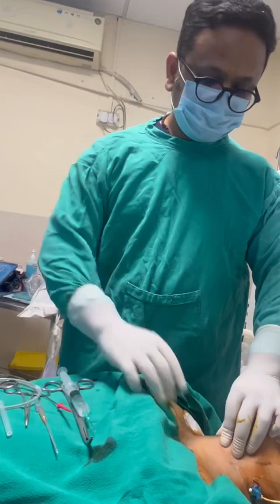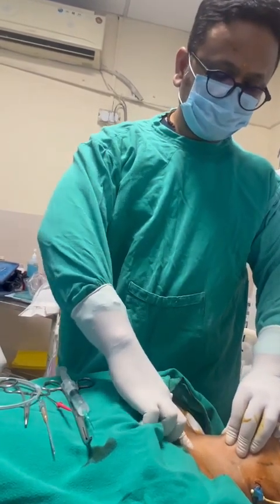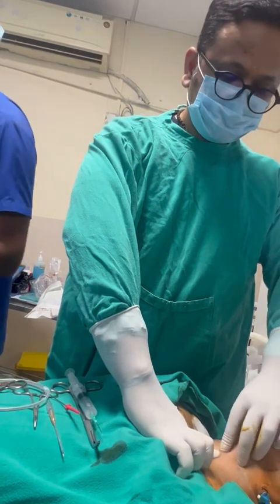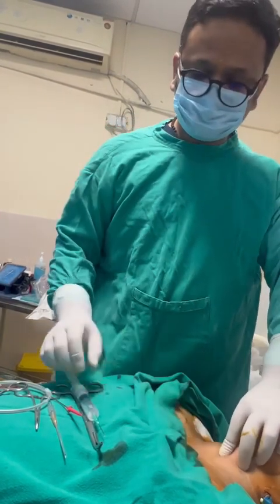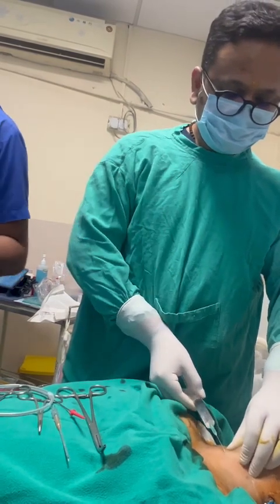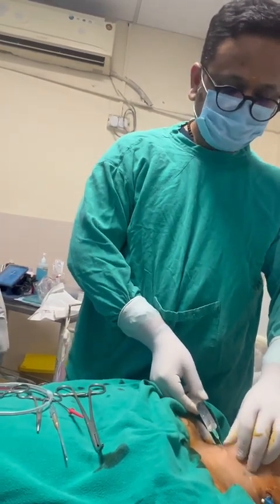Let's see. This is your sternum notch. Approximately 1.5 to 2 inches proximal to the sternum notch should be the cricoid cartilage. I can feel it also. So here I will give xylocaine in the area.